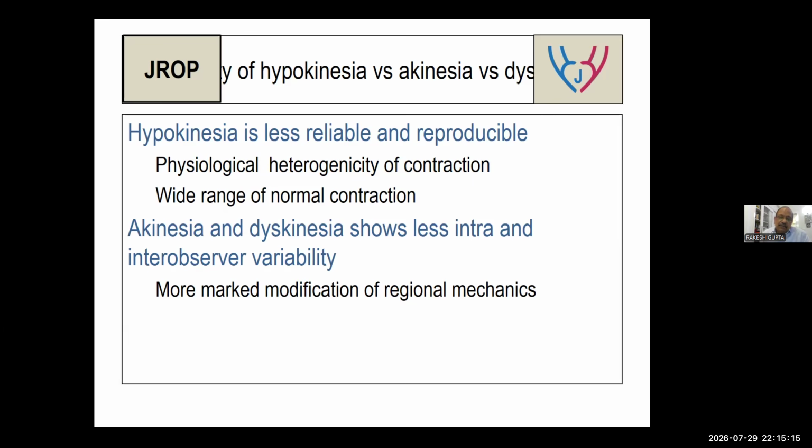It goes with the symptomatology, the enzyme levels, the troponin. Severe chest pain, ST elevation, wall motion abnormalities, but normal coronaries. So the take-home message is, whenever you see something, please correlate with the findings. Don't just jump. Look, this is Takotsubo. This is acute MI. This is myocarditis.